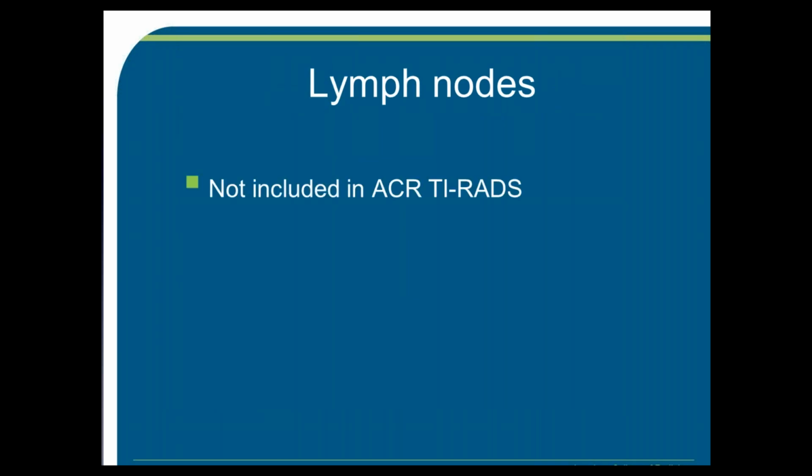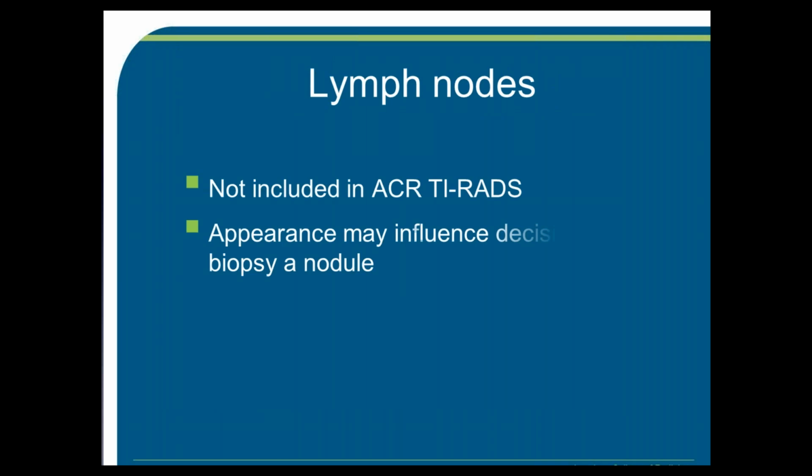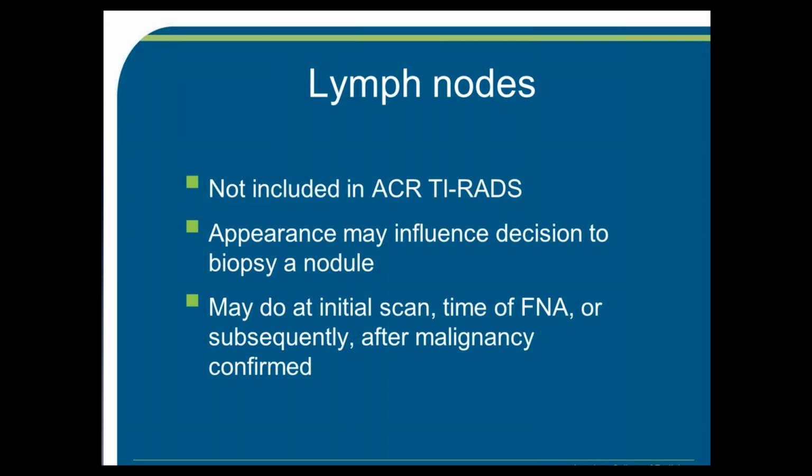Lymph nodes are not formally included in ACR TI-RADS either. However, their appearance may influence the decision to biopsy a nodule. The lymph nodes may be scanned at the time of the initial sonogram, at the time of the FNA, or subsequently after malignancy has been confirmed.